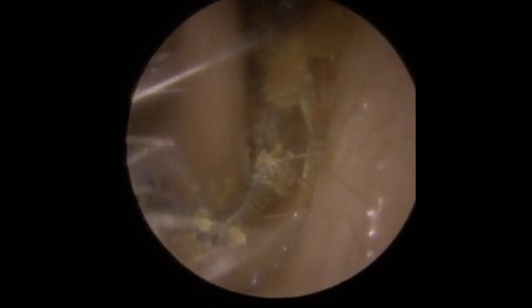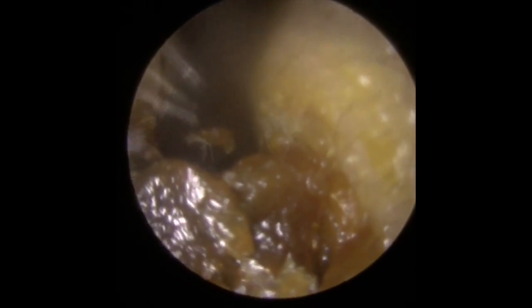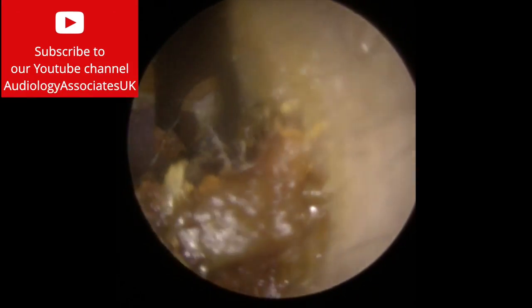What I've done first of all is spray a little bit of olive oil in there. It's going to help me get a better grip with the suction because you can see it's quite a polished surface in here. It also helps to get the oil underneath just to lubricate the canal. So when we do have a large piece of wax like this that's very dried out, it helps to kind of slide it across the skin. Tried the standard size suction tube first of all, tried a little bit of microsuction, but it couldn't quite get a strong enough grip to bring it out.